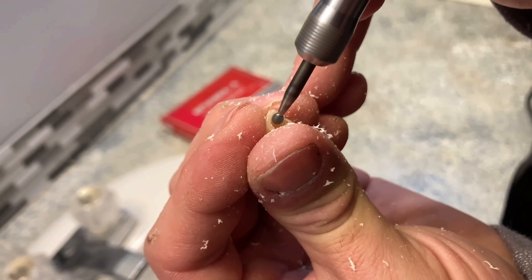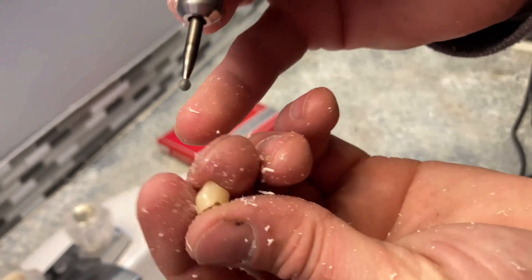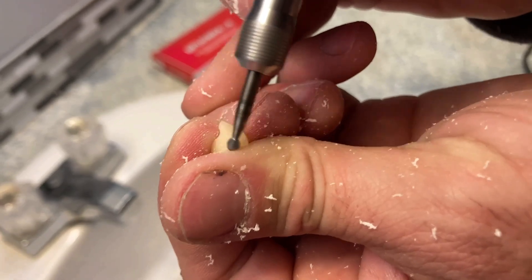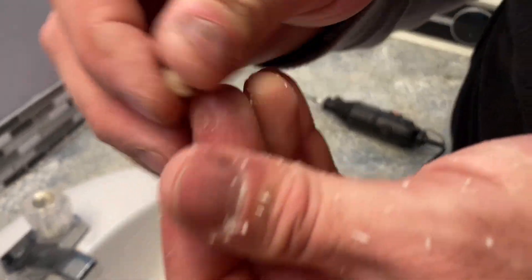I'm going to narrow this up a little bit and get these sides a little bit more. Now I just want to kind of test the fit and see how close we're getting. Still a little tight, so I'm going to take some more of the sides off.